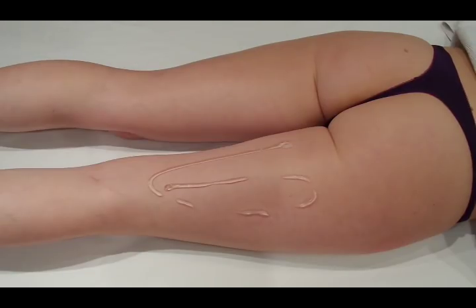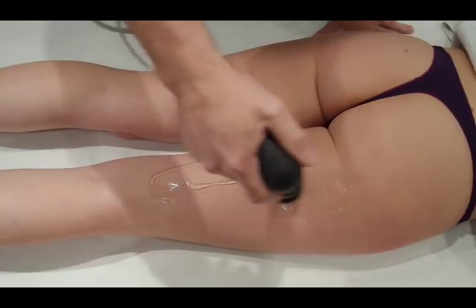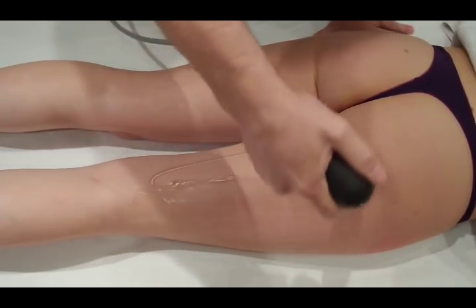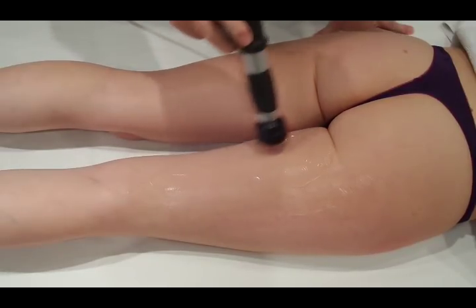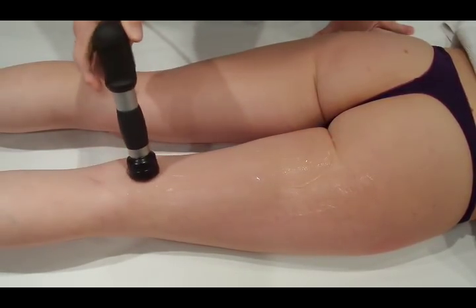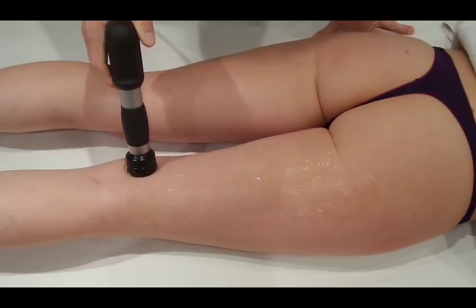It's a large area so it's a lot of gel over the back of the leg. We're going to spread the gel out before we start the treatment — you don't want to get to an area and get stuck on it. We've got a big area to go across.